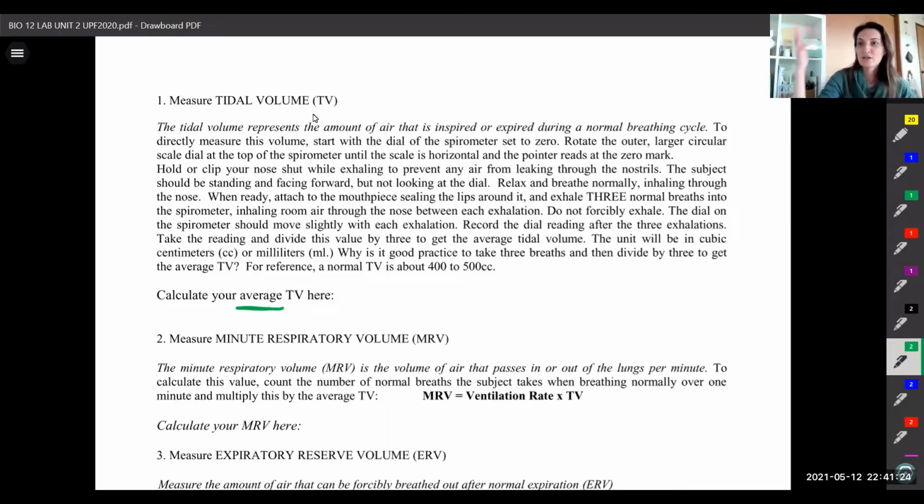Exactly, right. You get an underestimate of your lung volume because you would have air that's not going into the tube, right? Coming out of your lungs through your nostrils. And so that's something we have to keep in mind as well. Makes it, once again, a little more unnatural here. The fact that you're plugging your nose and you're trying to have a normal exhalation during the process.